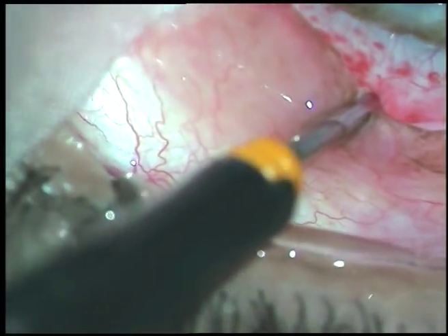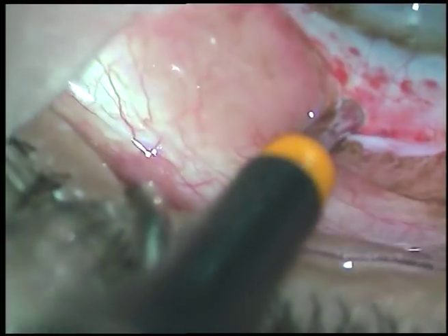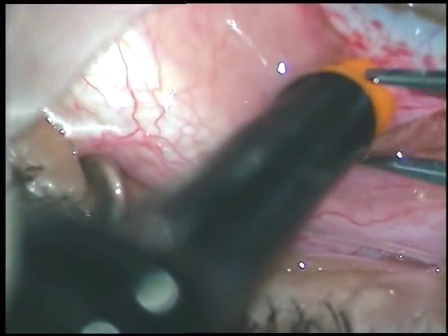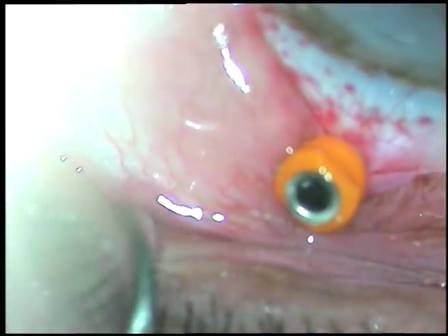So I have planned 3-port vitrectomy and removal of the big chunk of nucleus that has dropped into the vitreous cavity. And now doing adequate vitrectomy and making the nuclear fragment free from vitreous.